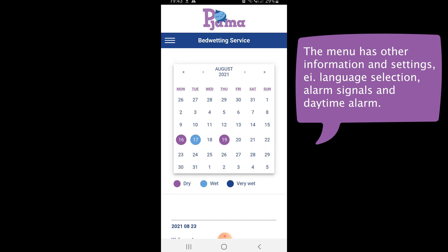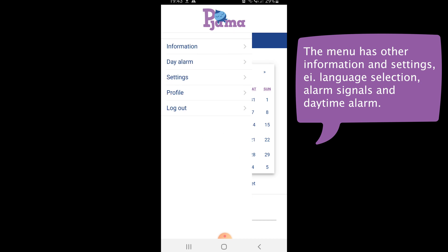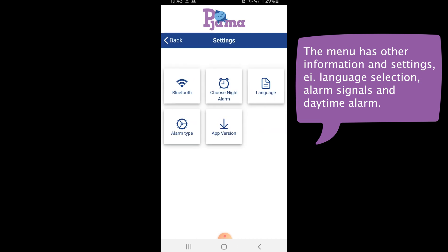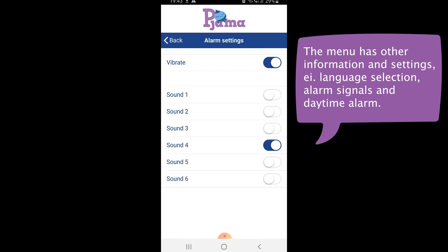The menu with information and settings is accessed at the top left. One setting that might be useful is to set the night time alarm signal. Enter settings and then choose night alarm. Here you can set the sound of the alarm on your phone or tablet, and whether you want it to vibrate or not.